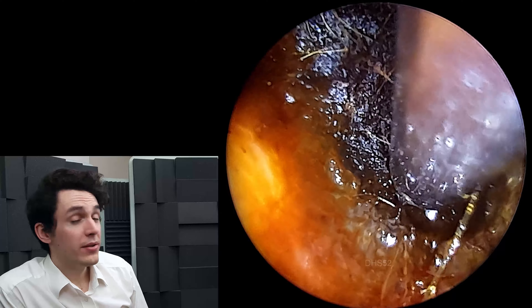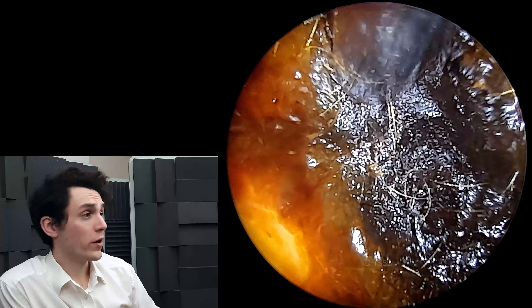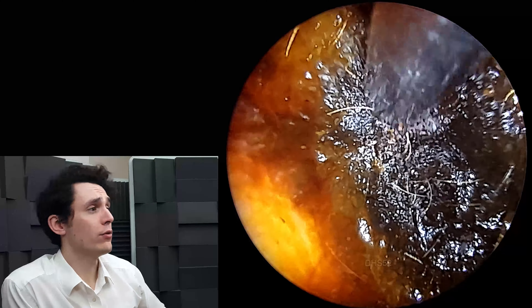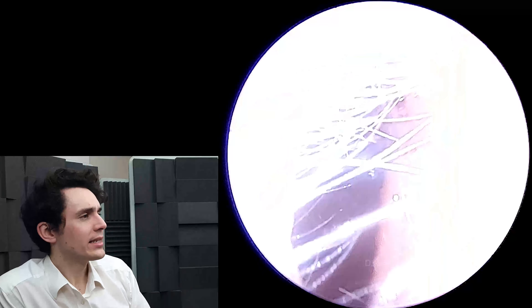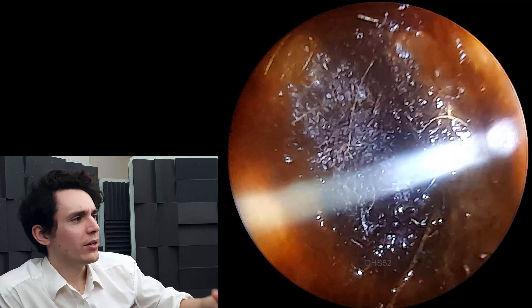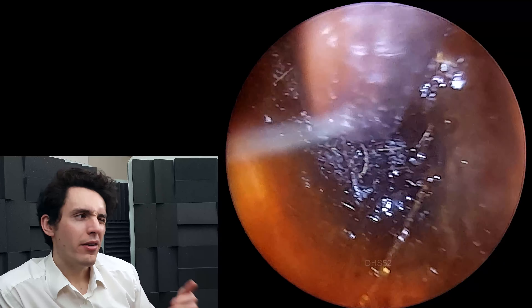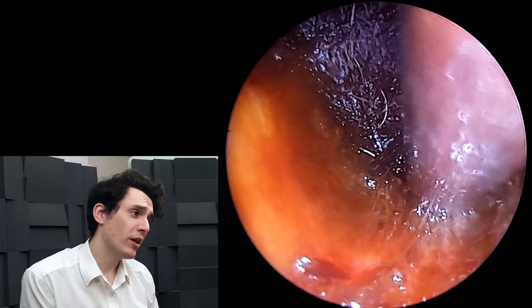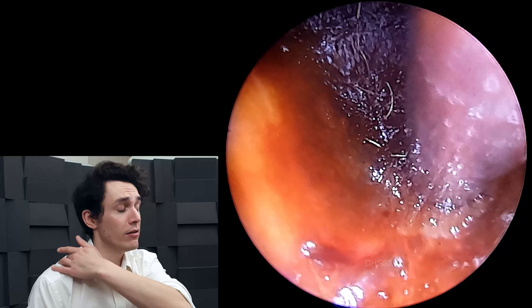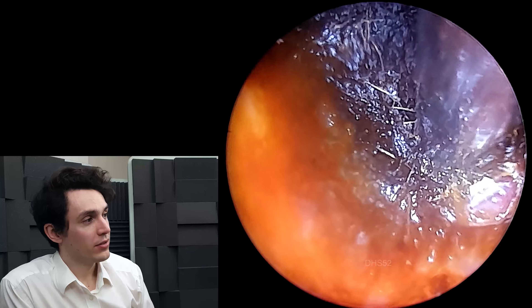You may be thinking at this point, why not shove a Jobson horn in? Why not shove a hook in or a Rosen insert or anything like that? The problem with these cases, as is always the case with these type of impactions and walls of wax, is that it's very, very difficult to judge the depth sometimes. Which is possibly a downside of using an endoscope rather than a microscope — it's very difficult to judge the depth perception.